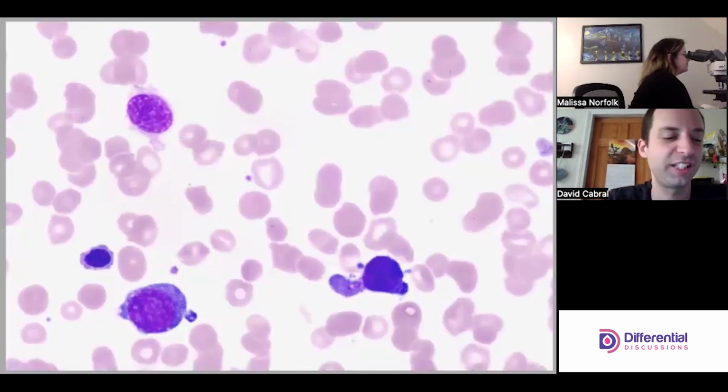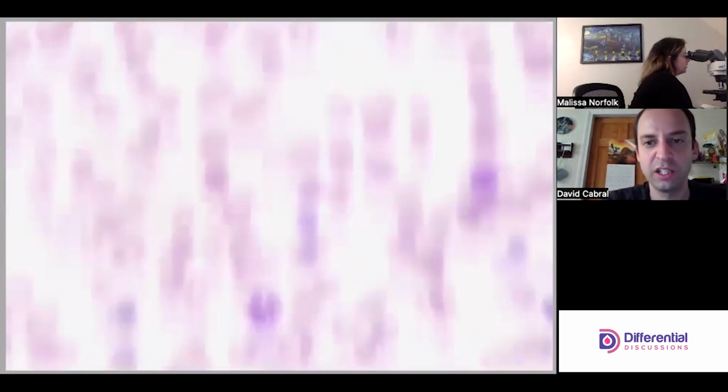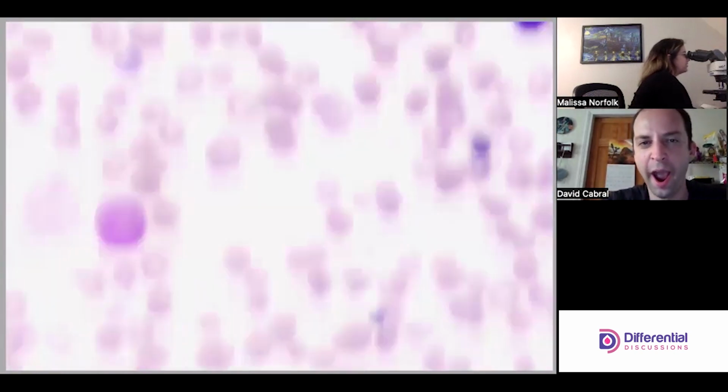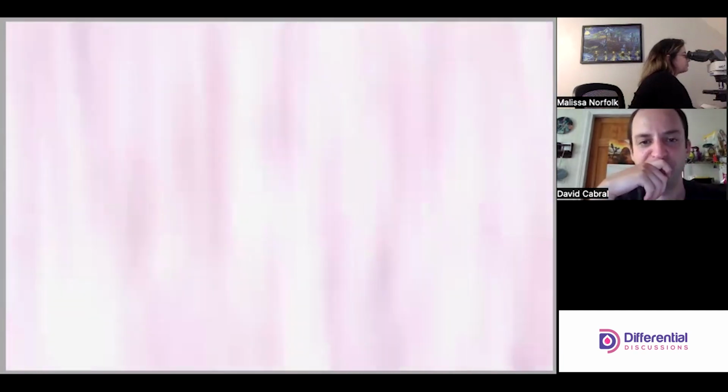There's one other cell type that we're trying to find for the audience. Kind of cruise around and see if I can find it. Excuse me, I apologize.